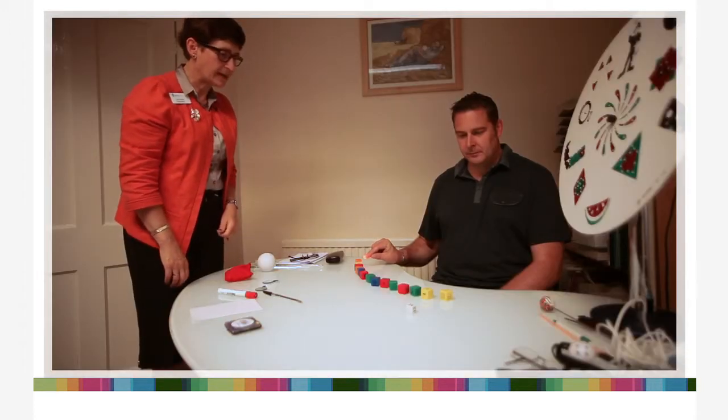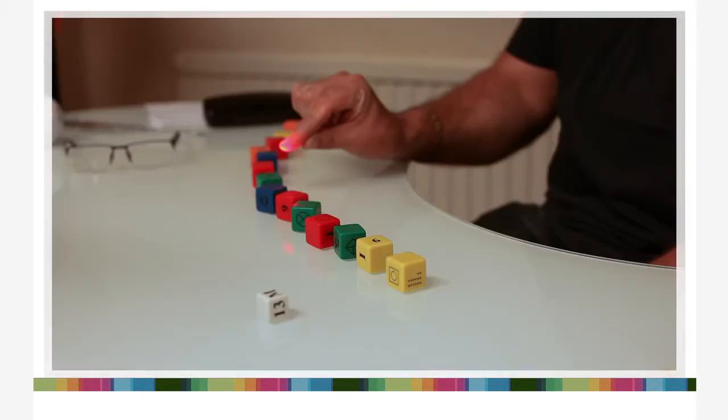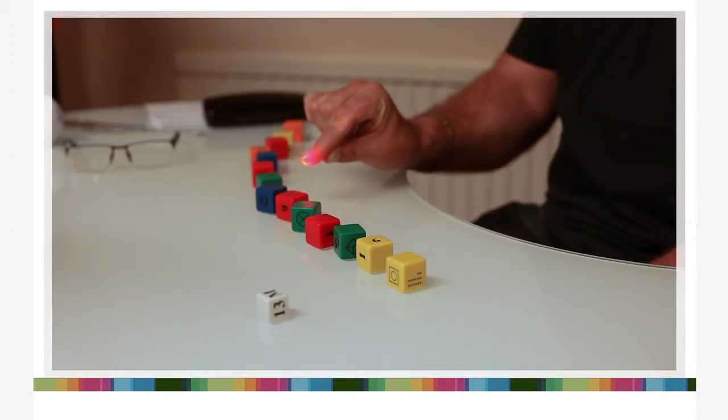If you've had a stroke, it's easy to become despairing and to think that nothing can be done. But it's very exciting to know that things can be done. Not only can we move the image with a prism stuck to the glasses, we can also go through exercises so that we can learn accurate eye movements. That's right. Now bring it closer towards you until you can see it. So this is without your glasses on.